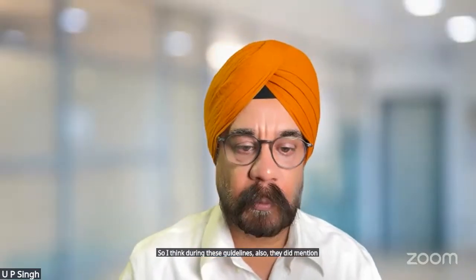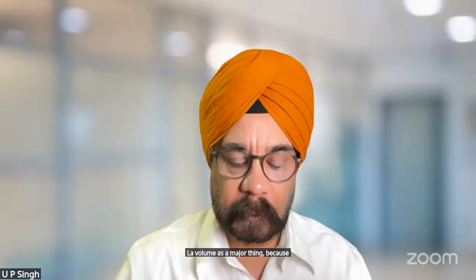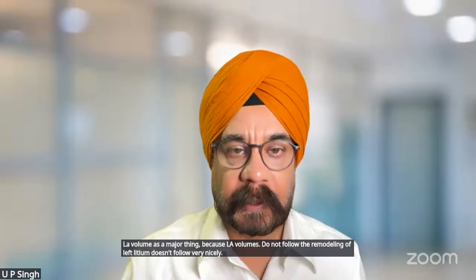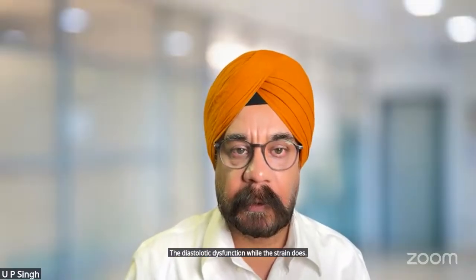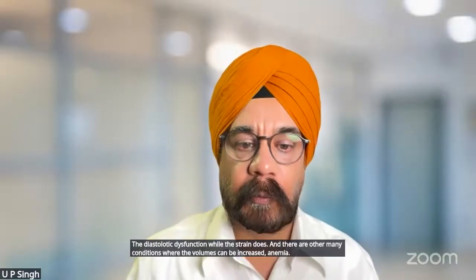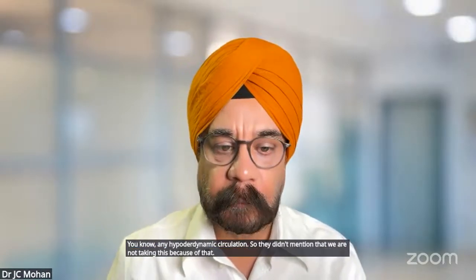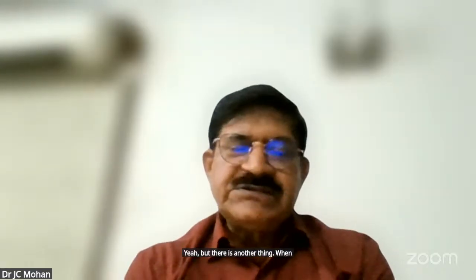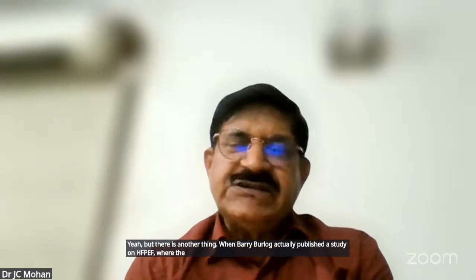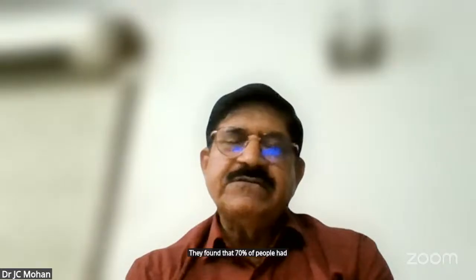During these guidelines they also did put up a note that we are not taking LA volume as a major thing, because the remodeling of the left atrium doesn't follow diastolic dysfunction very nicely, while the strain does. And there are many other conditions where the volumes can be increased, anemia, any hyperdynamic circulation. Yeah, but there is another thing. When Barry Borlaug published a study on HFpEF, where catheterization was done in each and every case, they found that 70% of people had left atrial volume less than 34 ml per meter square.